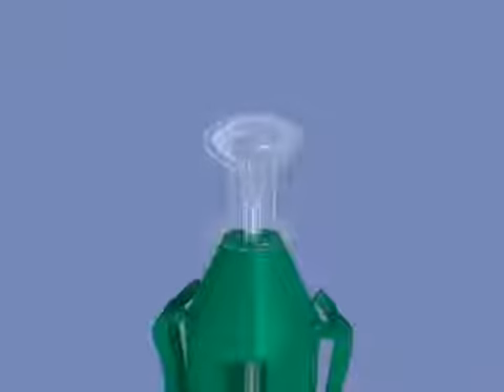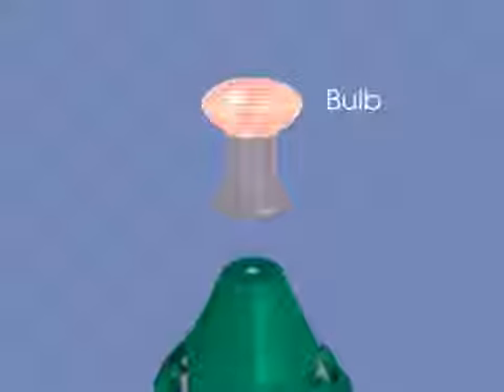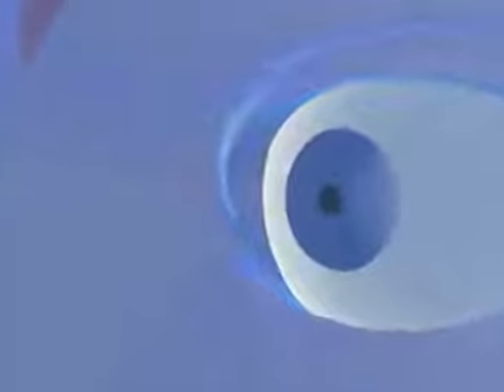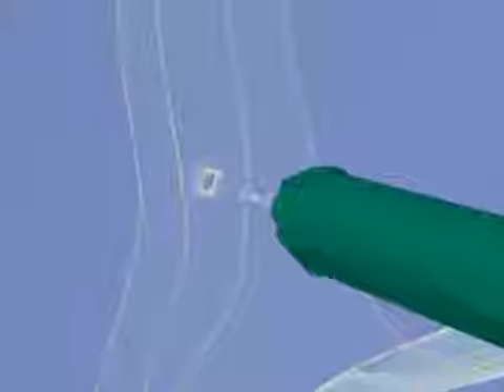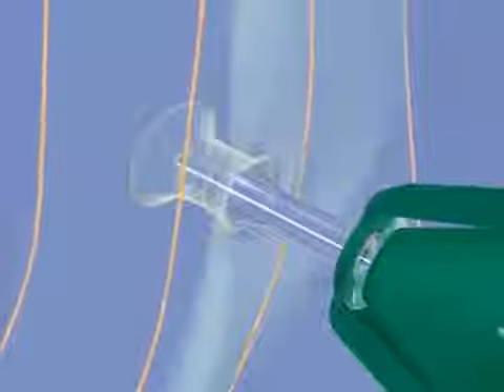The silicone punctum plug consists of three parts. A bulb which lodges in the vertical portion of the canaliculus and prevents the spontaneous expulsion of the plug. When stretched on the plug inserter, its diameter is reduced, which means that dilation need not be performed when inserting the plug in the lacrimal opening.